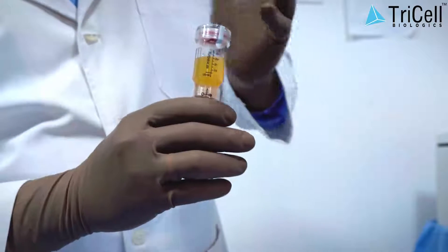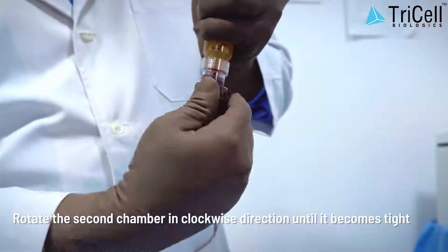Step 7: Rotate the second chamber in a clockwise direction until it becomes tight.